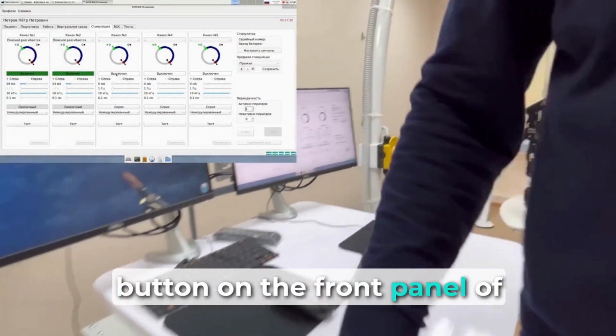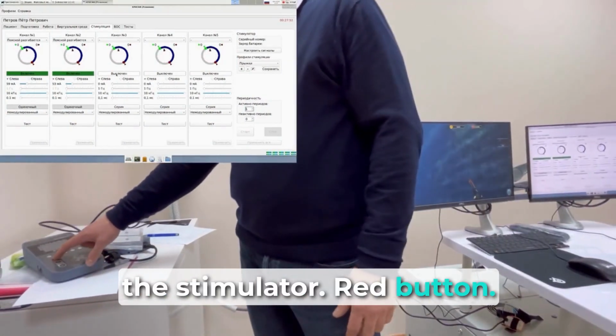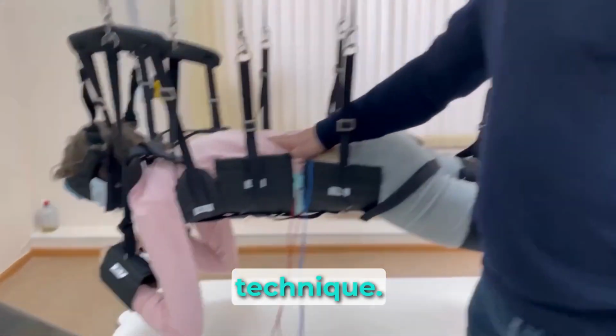Or it can be done with the Stop button on the front panel of the stimulator, the red button. Let's show one stimulation technique.